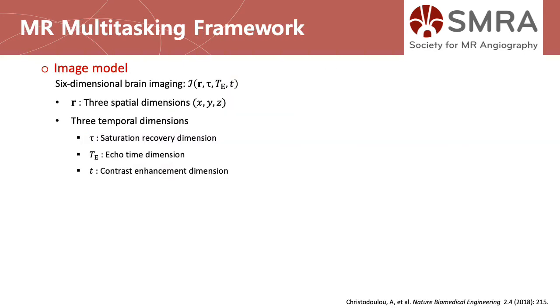Our reconstruction is based on the MR Multitasking framework. Specifically, our 6-dimensional image model contains 3 spatial dimensions for 3D imaging and 3 temporal dimensions, namely the saturation recovery dimension, echo time dimension, and contrast enhancement dimension, respectively.